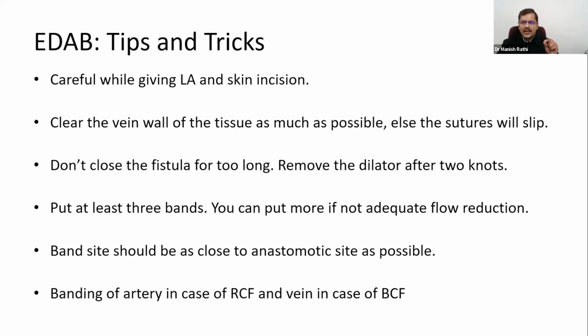And this is the vein which is carrying 2.5 or 3 or 4 liters of blood flow every minute. You will be in big trouble if you are not careful handling this vein. So this is very, very important. Be very careful while giving local anesthesia and making the skin incision.